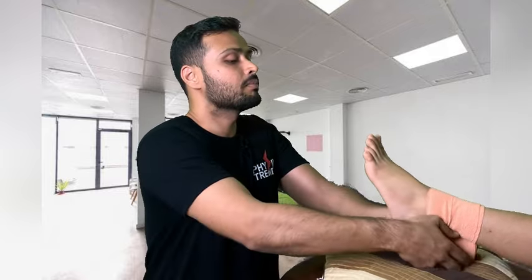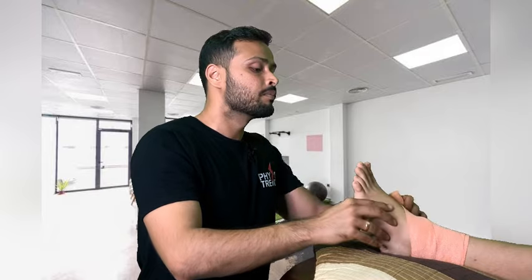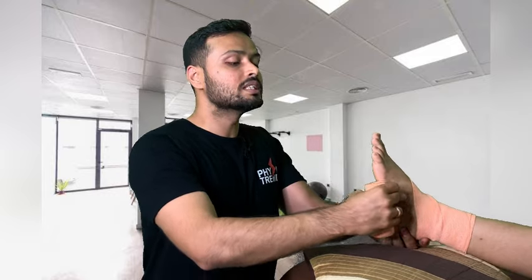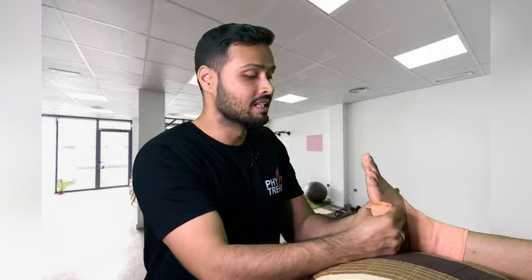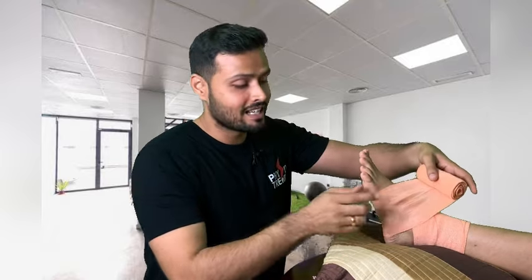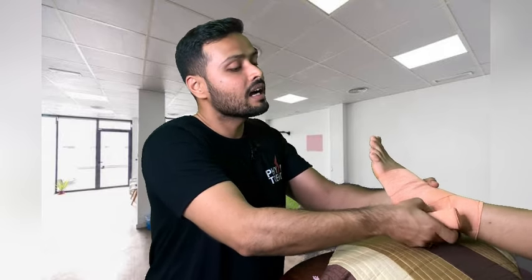Once the two anchor circles are taken, I am going to take it towards the ankle. What I am doing here is pulling the ankle towards eversion. We want to make sure it is not going into further inversion, which would damage the ligaments on the lateral side. That is why we bring it towards eversion — and that is the correct way of doing it. Now here comes the magic of the figure of eight: wrapping it around, bringing it back over, and then bringing it down again.